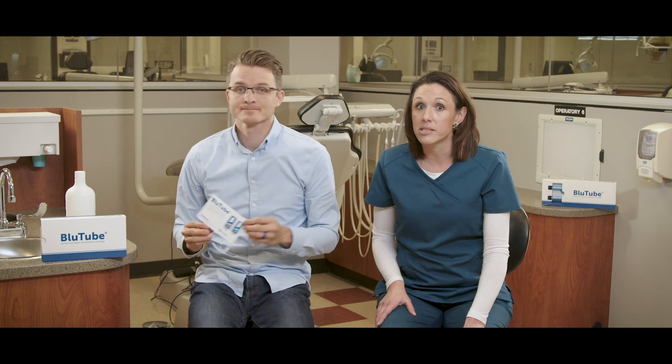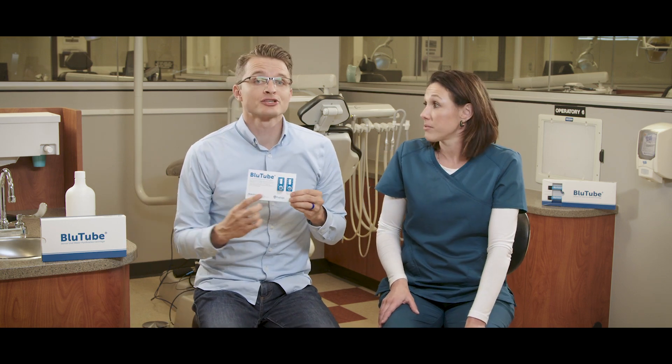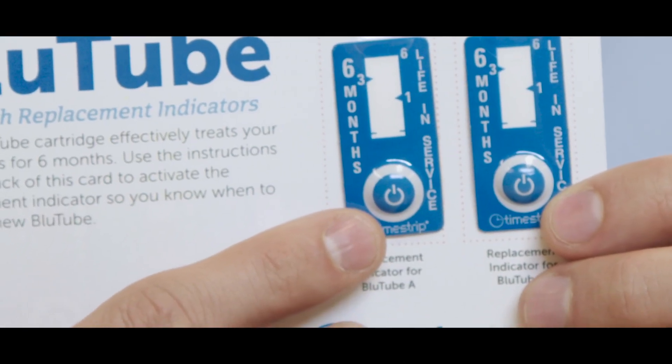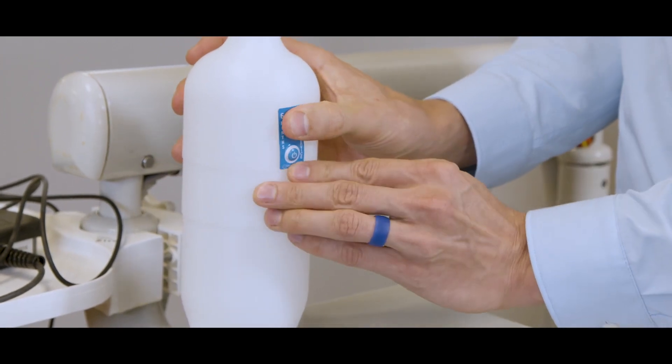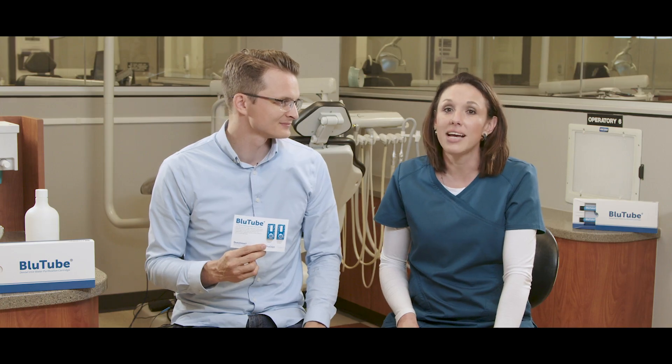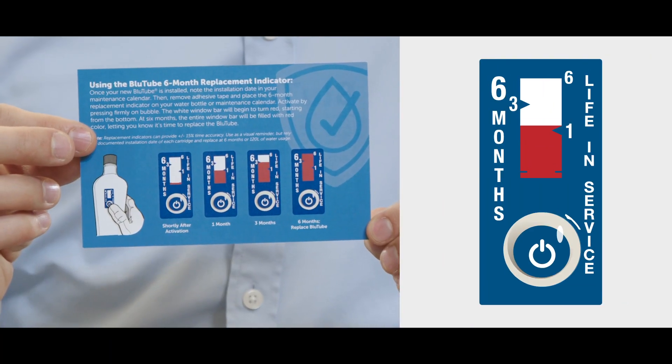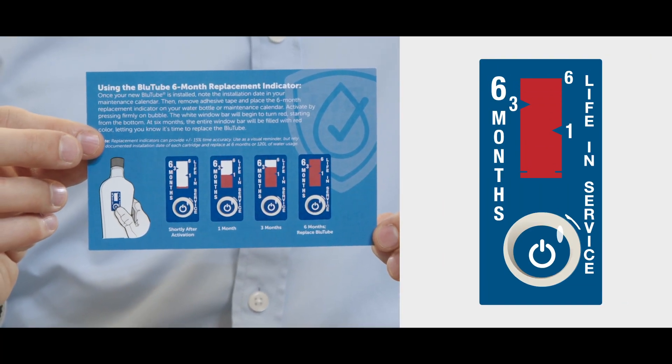Bluetube also comes with an automatic chemical replacement indicator, so you're easily reminded when the six months is up. Just push the power button on the chemical indicator, stick it to your dental unit water bottle or maintenance calendar, and let the science do the rest. Over the next six months, you'll see the window fill red. Once the window is completely full, you'll know it's time for replacement.